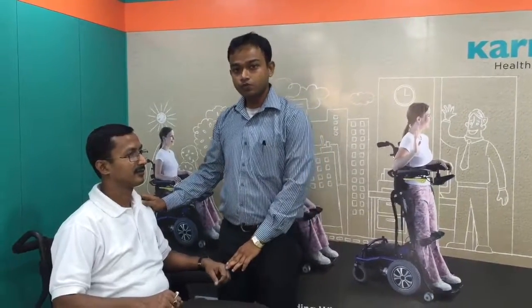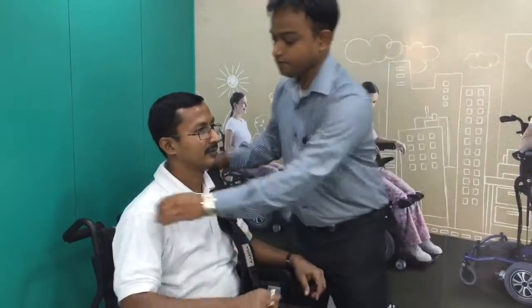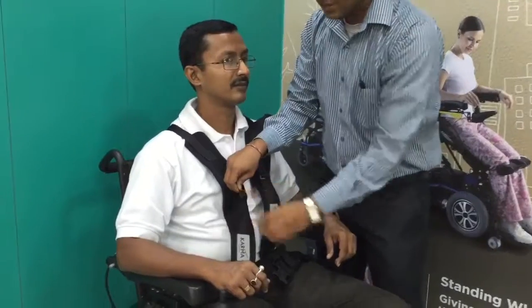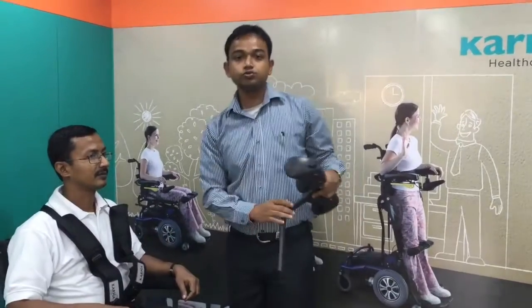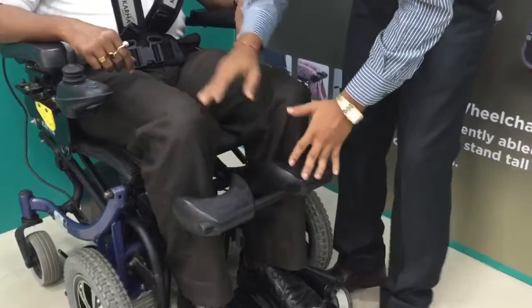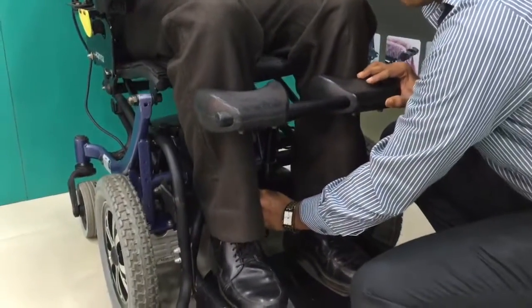Now we are going for a demo of the KP80. Before first use, you should ensure that the H-shaped safety belt is tightened according to the size of the patient. There are adjustable straps to adjust the sides. After adjusting the seat belt, you need to use the knee support. It is required to support your lower limbs when using the standing mode. You can adjust the gap between the kneecap and your lower limbs using the knob provided.